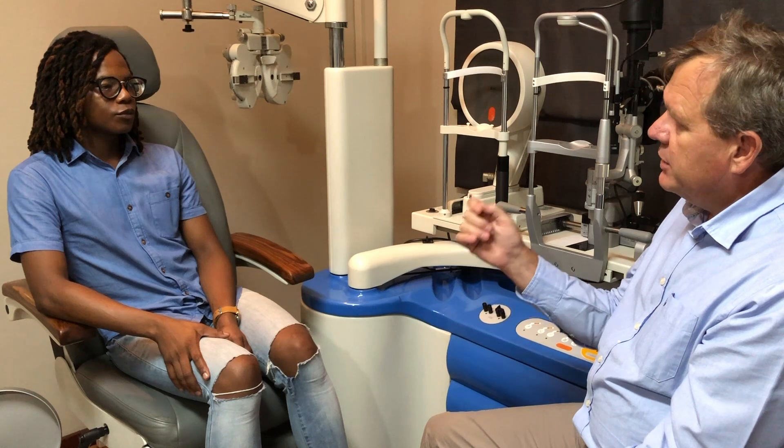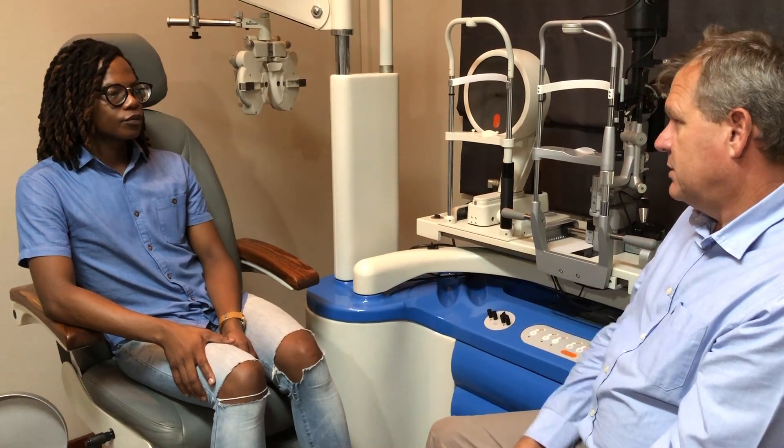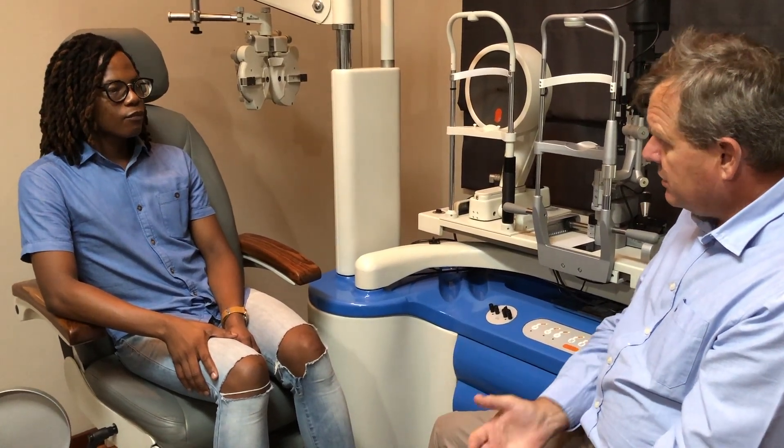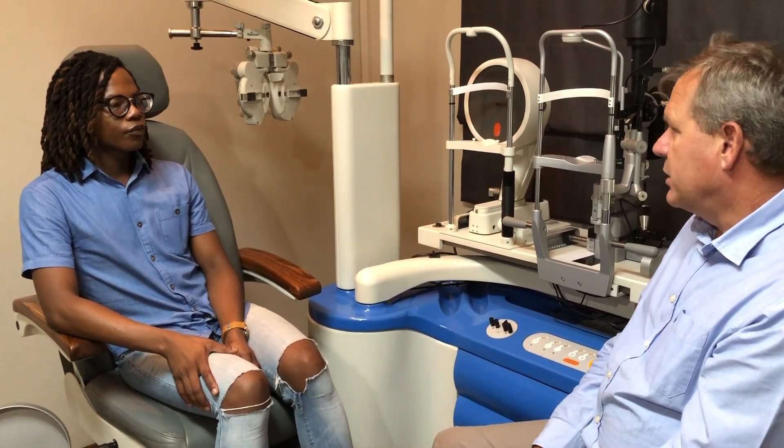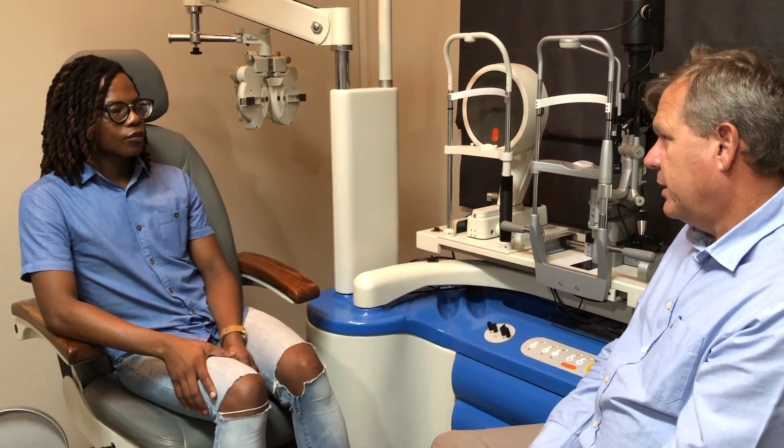So what I'm going to do now is test your eyes to see what your prescription is, then look with a microscope to see what your eye looks like, and then we see what works for you and take it from there.